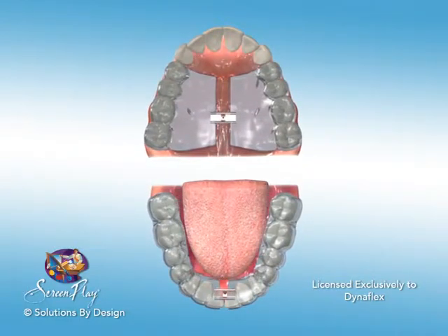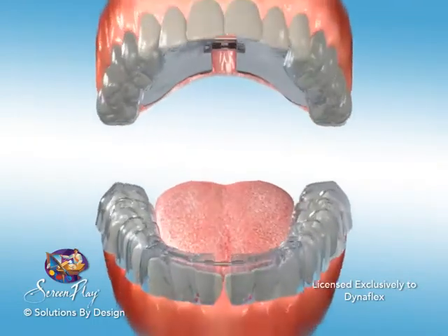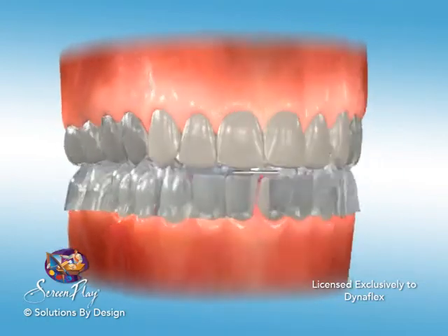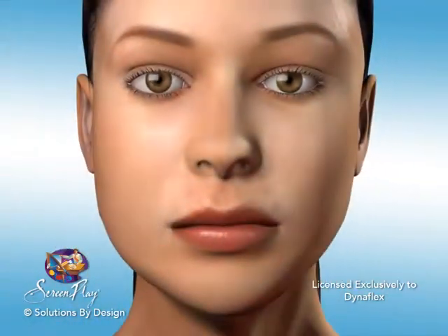This appliance is ideal for situations where the teeth in the upper and lower arches are crowded, and is an aesthetic choice for pre-aligner treatment. It can oftentimes eliminate the need for interproximal reduction.